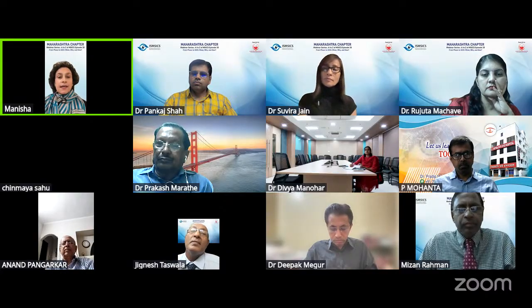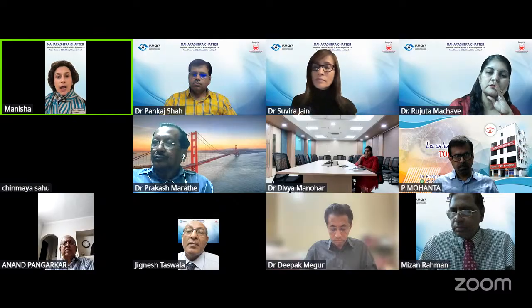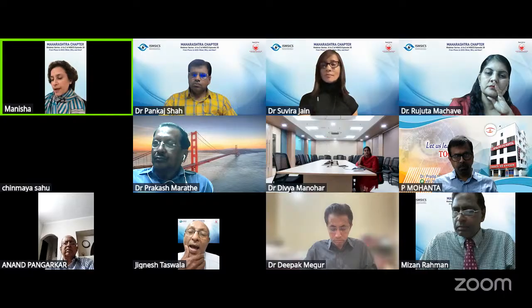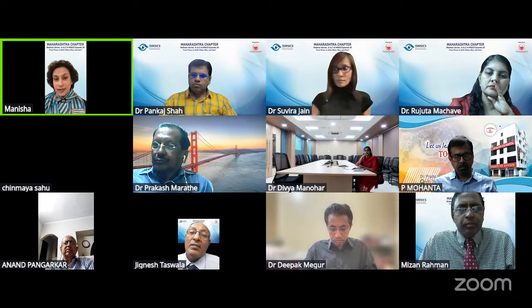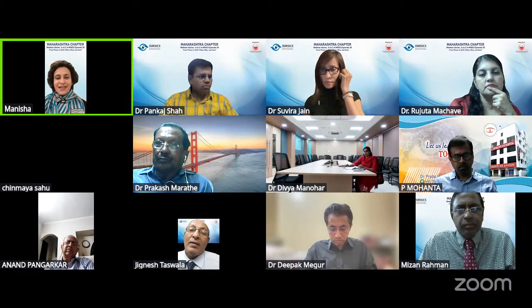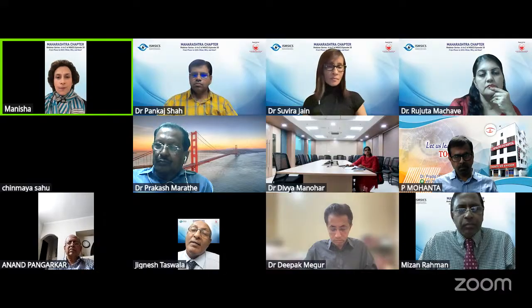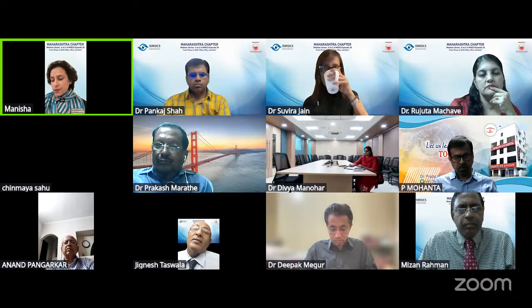Then, another important point that Dr. Pradeep said: do not run after a runaway rexis. Stop and manage. That was also very important. Then the cleaning of the viscoelastic behind the lens was also very nicely done and very important. Again, the suture is debatable, because even if you don't, of course, do not compromise, but those tunnels we were seeing are really good, and post-op pictures are very good.